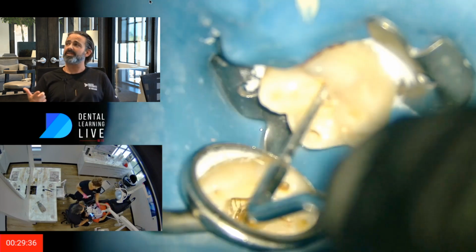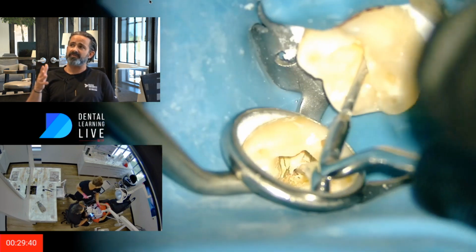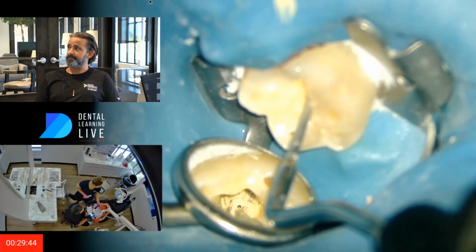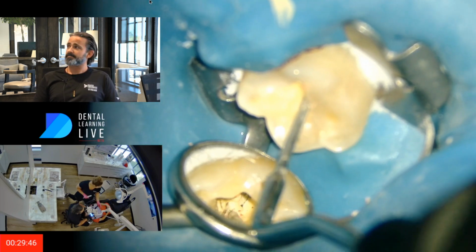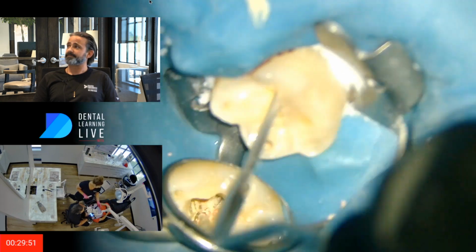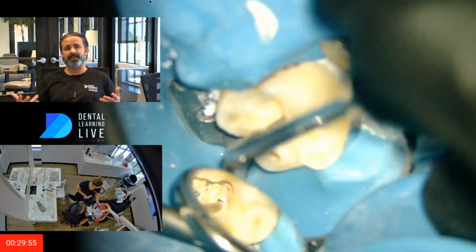Now, the question is, what do you do against that composite? So I'm going to show you how I flow into that space. I don't want to leave that space open. As soon as I finish playing with the floor. Clean up. People talk about clean up. Lots of different ways to clean up.